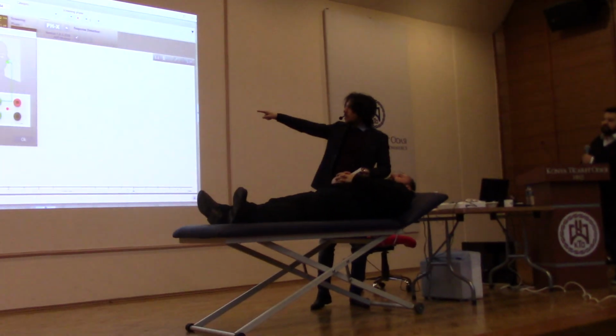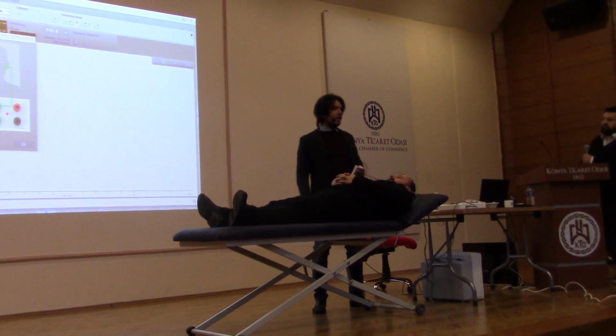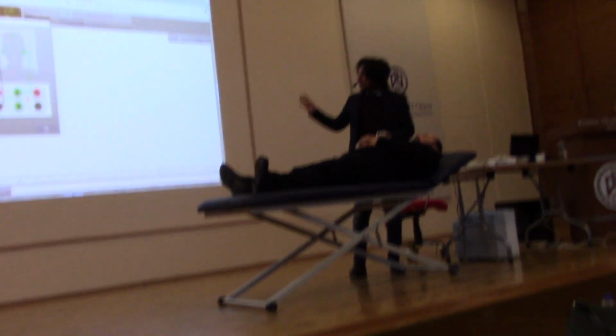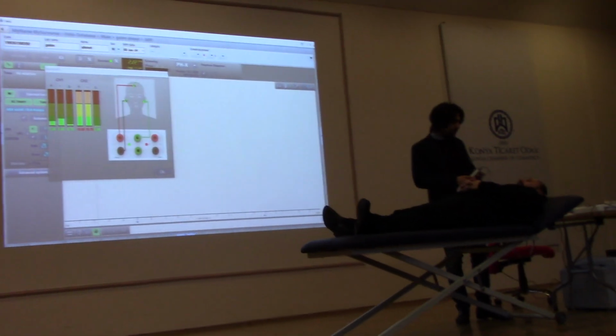This channel has a black connector that is defined internationally as the negative one, a red one that is the positive, and green one that is the common.